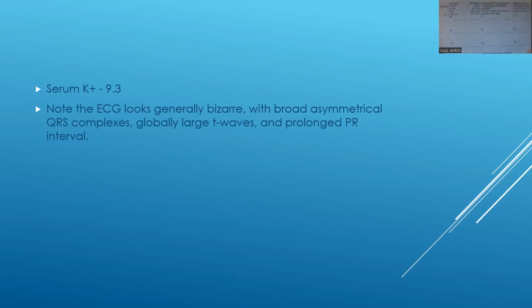I didn't see any P waves either. I ended up taking him to the local hospital thinking that this was a hyperkalemic ECG. And I didn't get any pushback from that. They did ask me had I consulted cardiology to make that decision. I said, look, no, it was just more consistent with his history.